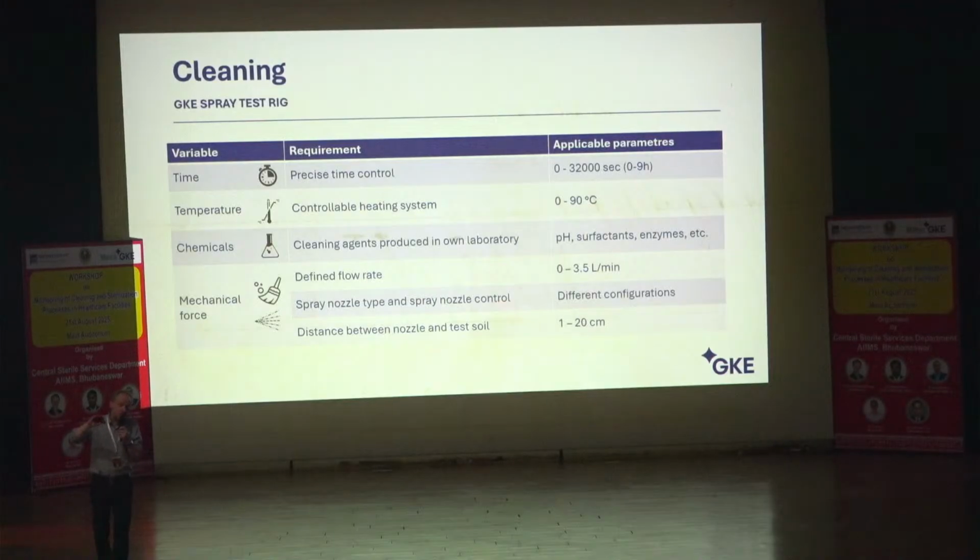The difference was not critical for everyday use. So if any hospital would have bought these products, no problem with that. But in this machine, testing is so precise that we saw big differences whenever we bought a new container of detergent. And our consequence is that today our test detergents, we make them on our own. We have in our laboratory a kind of kitchen, and there we mix together our test detergents so we know what's inside. And we do not depend on what we buy.